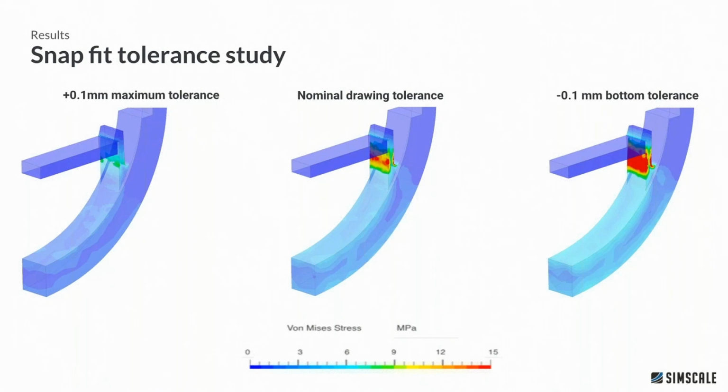And at the minus 0.1, so the bottom tolerance, we do have some reasonably high stresses, and there is a risk that we would actually exceed the plastic yield of the material in these regions and introduce permanent deformation. The other concern here is if we're at bottom tolerance and there's a very high force required to assemble these components, it's an ergonomic concern potentially for those people that are assembling these components on the production line.